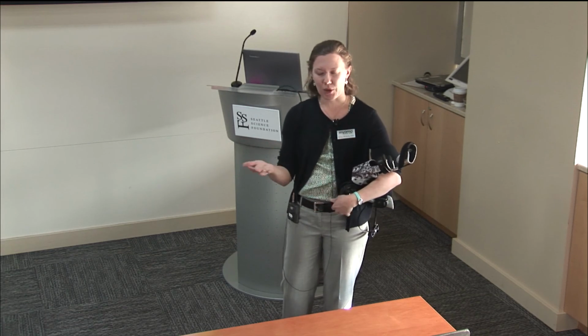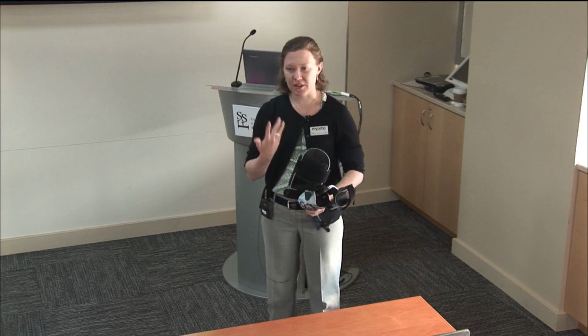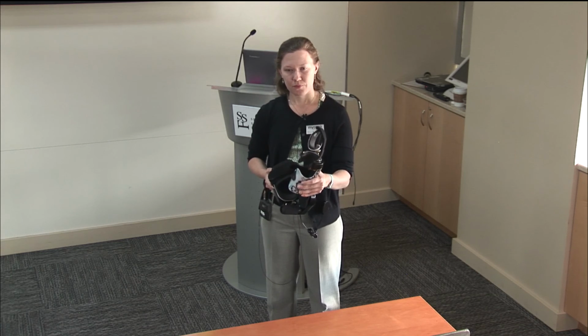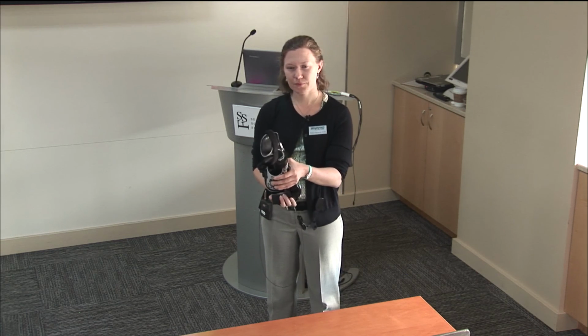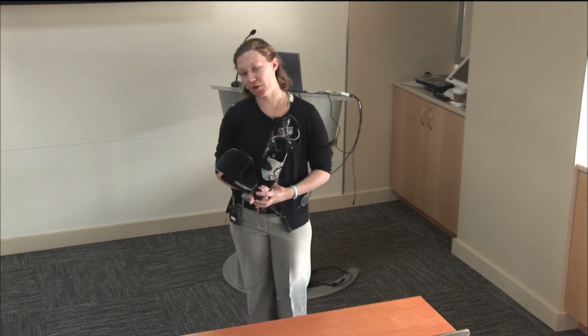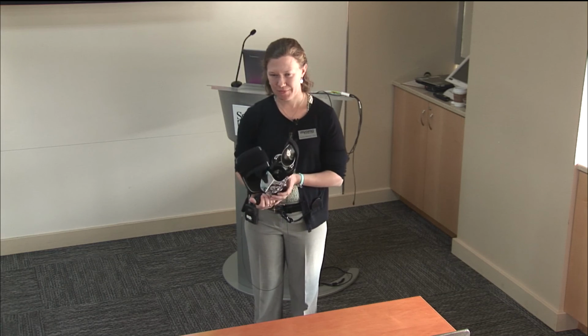Honestly, if you have a patient that you're going to totally lock it down for, you're probably going to fit them in just a static wrist anyways, because as you said, there is an increased cost on that addition. So none of the wrist or forearm motions are powered? Not at this time. It is something that we are exploring for future purposes, but not at this time.